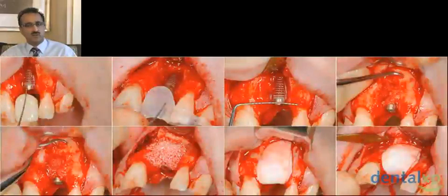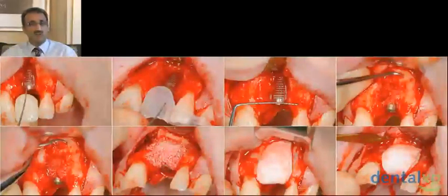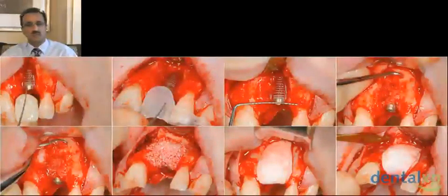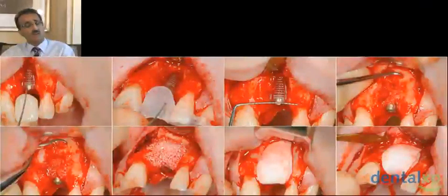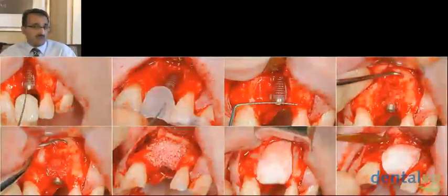So here we go. We can see the steps through the surgery of this patient. Placing our implant in the ideal three-dimensional position, 3 millimeters apical, 2 millimeters palatal to the final gingival margin. You can see a lot of the threads are exposed. We tend to bring some scrapings of autogenous bone from the apical aspects of the site that we're working on. You may not really have to do this.